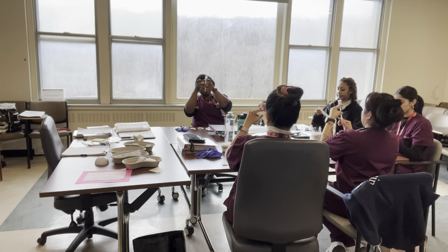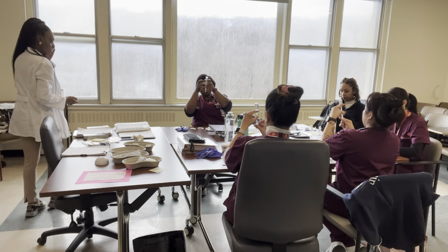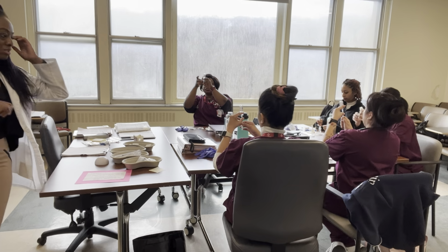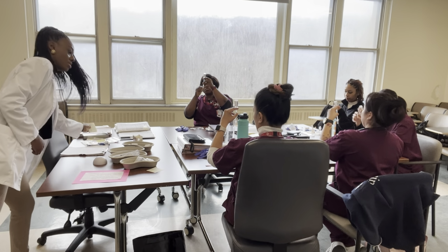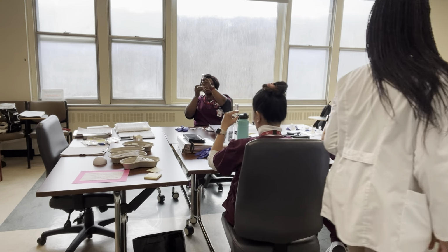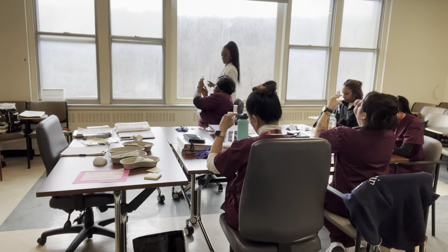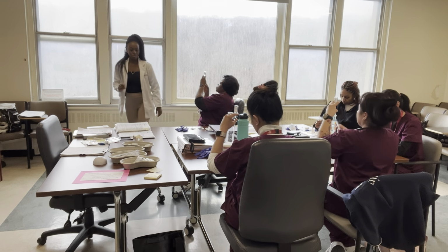You're welcome. Anybody else with a bent needle? You're good. So your fingers around the neck of the vial. The neck of the vial. There you go. That looks good. What's your final answer? You have to have your final answer. How much insulin to draw up on your paperwork? You should have your final answer. Your needle's being bent. You need to keep it straight. There we go. Good.